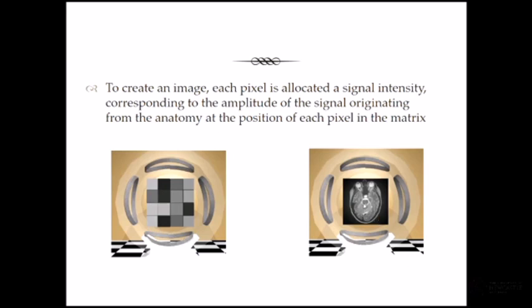Okay, so the finer number of steps, frequency encodings and phase encodings, will give us how much spatial resolution we acquire in our image. And that spatial resolution tells us how fine a structure we can see. Okay?